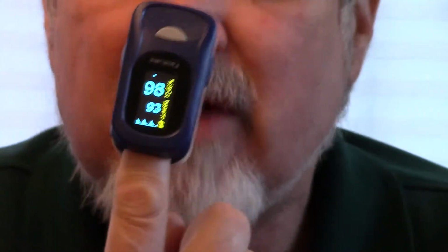Now remember, at the beginning of a treatment, you may find that after one treatment, the number goes down a little bit for a few minutes and then starts to go up beyond the level it was before you started. So say it was 92, and then you do an oximeter reading, it goes down to 90, but you wait a few minutes and it goes up to 94. That's the response to the medication.